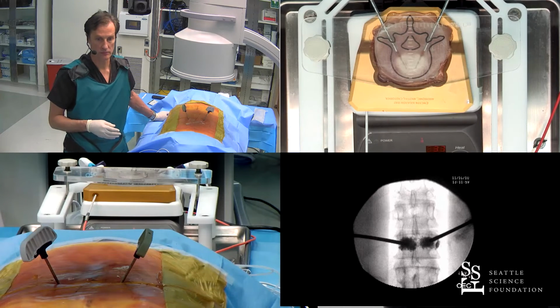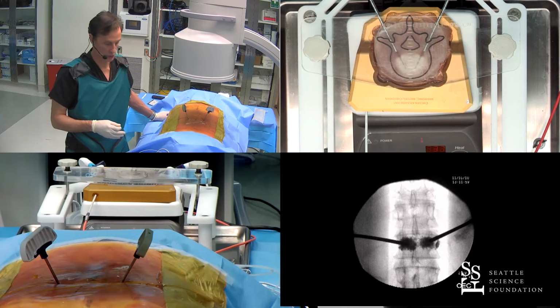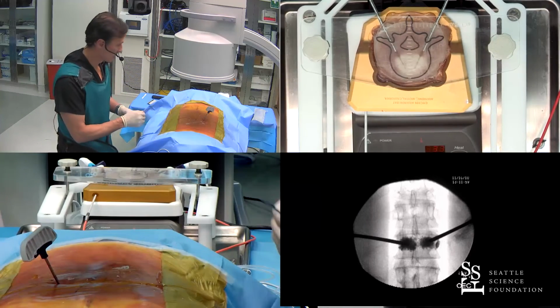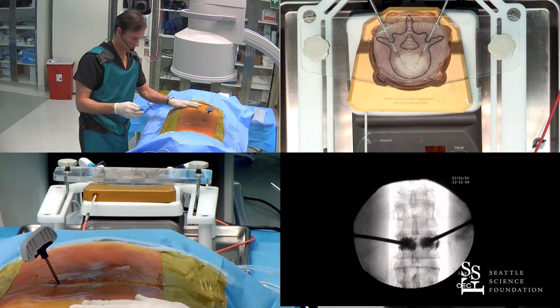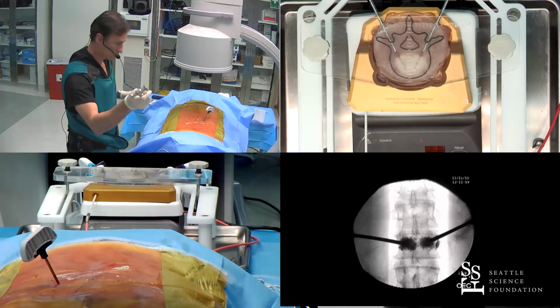Excellent. Did it show like a perpendicular, like a T6? Yeah, do you have time? I think we have some time. Can we go up to a mid-thoracic level and show that approach? Sure. You want me to demonstrate at thoracic level? Sure. Absolutely. Let's move up a little bit. Any questions in the meantime?